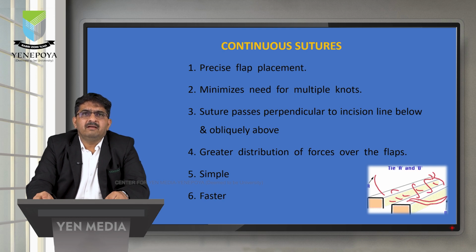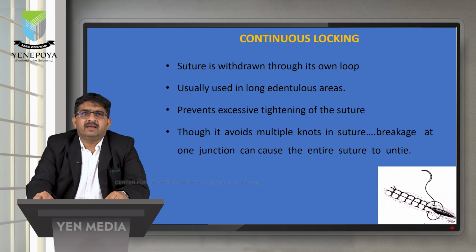It is simple, faster, and then we have continuous locking, wherein a locking is provided so that the suture is held in place without any relaxation.